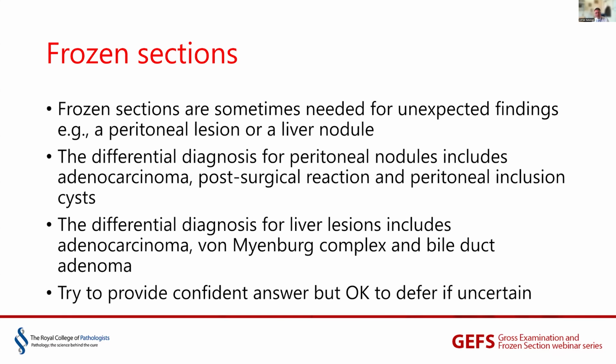Or bile duct adenoma, that's usually a rather more closely packed collection of bile ducts, so often with inflammation, often with portal tract structures, but without significant atypia, usually without mitotic figures within them, and with an edge that is smooth, without obvious evidence of direct neoplastic epithelial involvement of the adjacent liver.